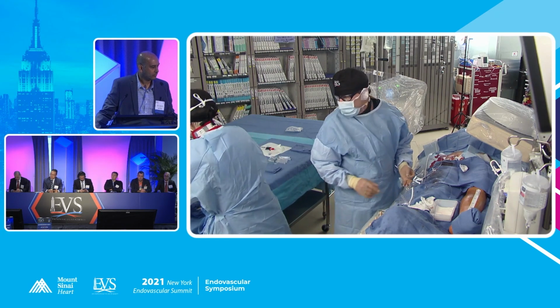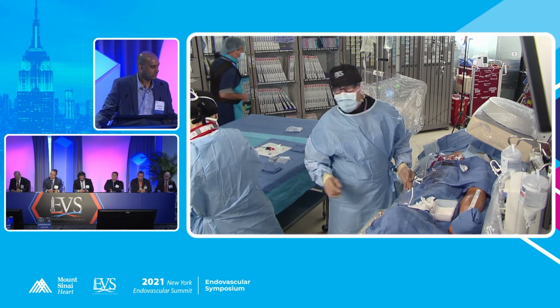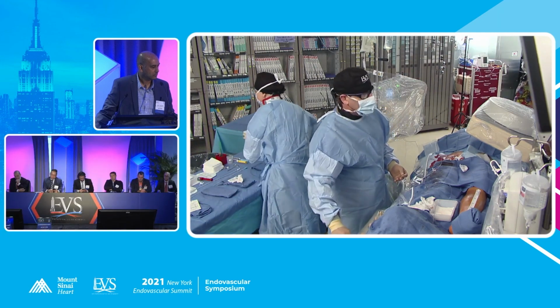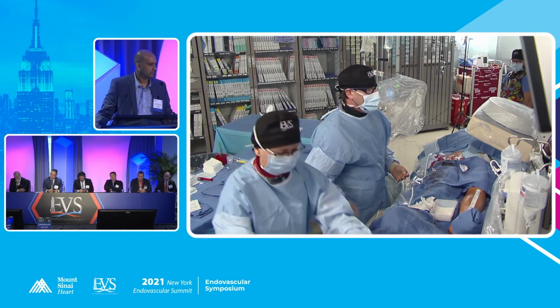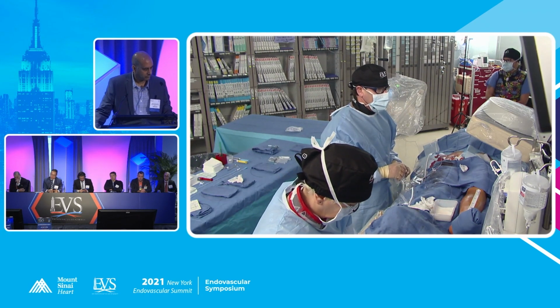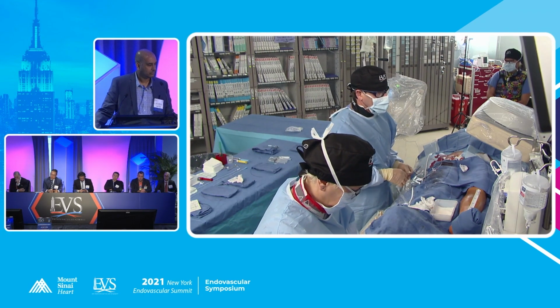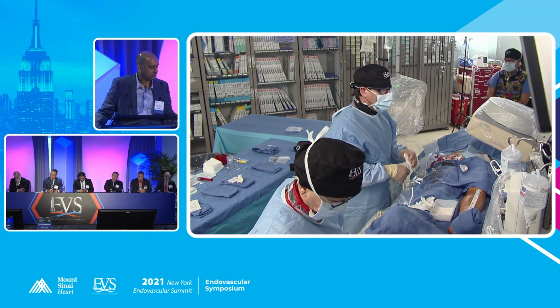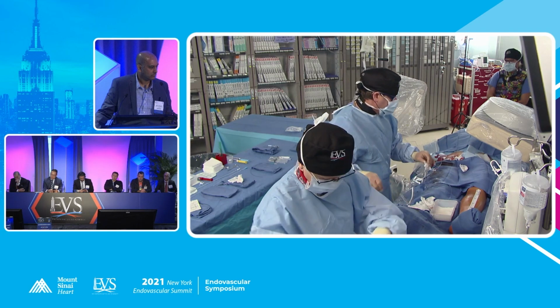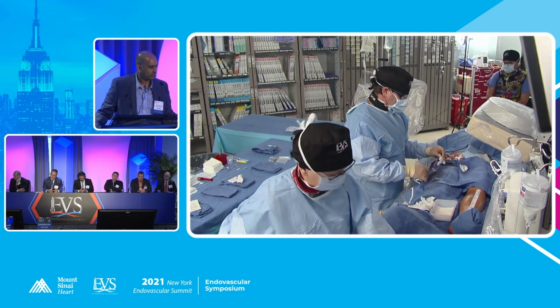And now finally, we have the 7x60 Shockwave. And we do have larger sheaths that just came out within the last few weeks, 7.5, which makes it a lot more reasonable to do. If you have to stent, I would never put a nitinol stent in the common femoral artery. It would always be an interwoven stent so that there's no fracture, so that it bends with the patient when he or she bends, and that it stands up to the calcium.